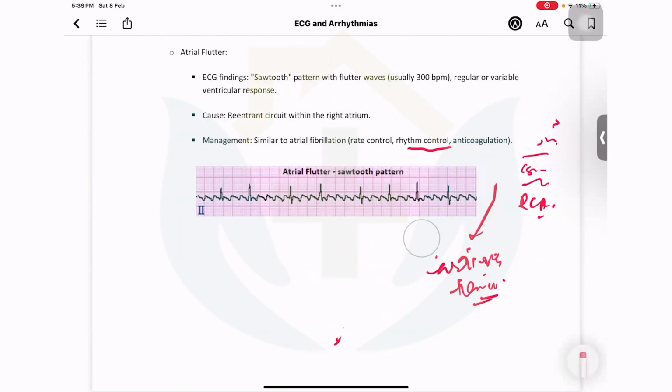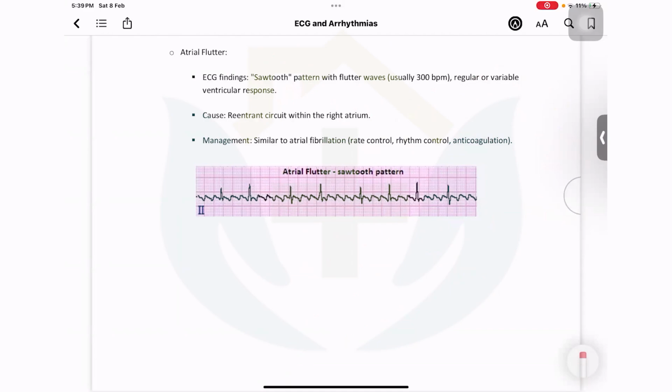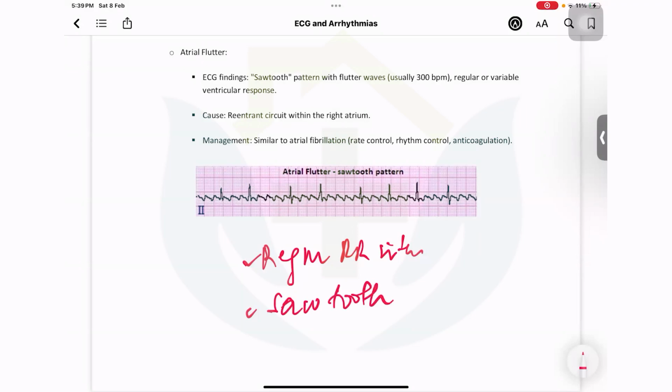So that is known as atrial flutter. Again, a supraventricular arrhythmia. What distinguishes it from atrial fibrillation is a regular QRS, a regular RR interval. And instead of a fibrillatory baseline, it has a proper baseline known as sawtooth appearance, basically formed by a lot of P waves clustered together, out of which only few can go. So this is atrial flutter.